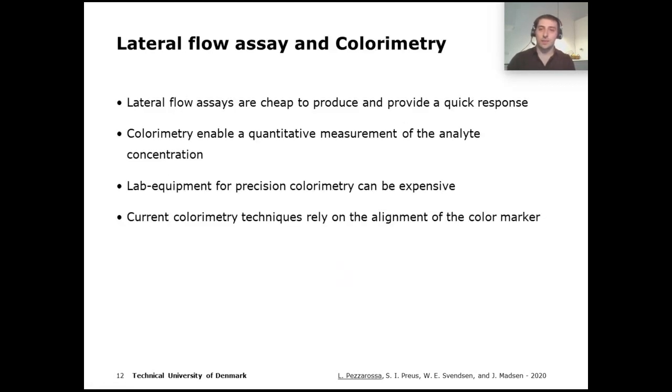Lateral flow assay, together with colorimetry, have several advantages. They are cheap to produce and provide quick response, making them very suitable for point-of-care applications. Colorimetry allows a quantitative measurement of the analyte concentration, in this case the amount of bacteria. However, the lab equipment for colorimetry can be expensive and it is quite bulky.